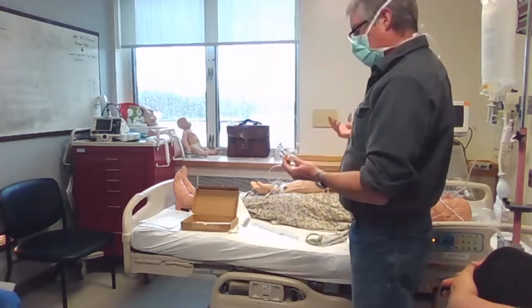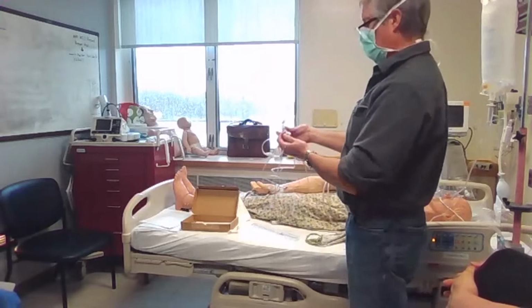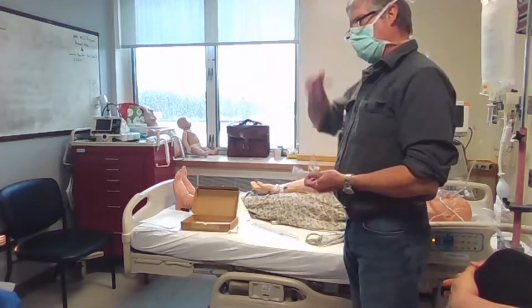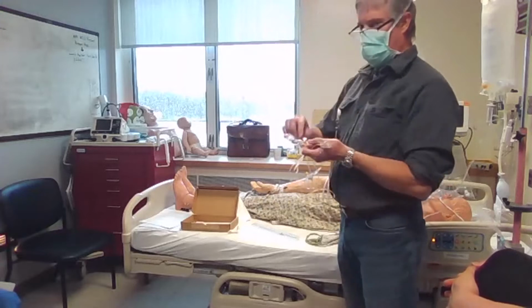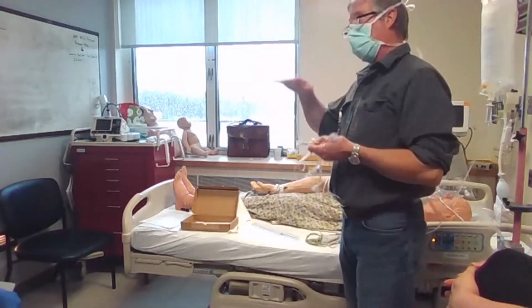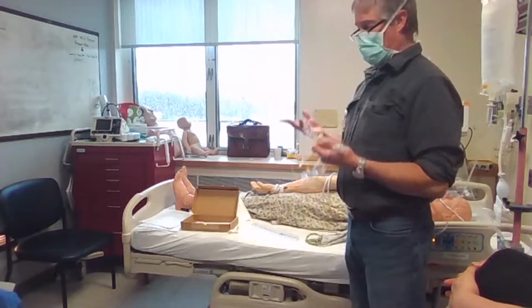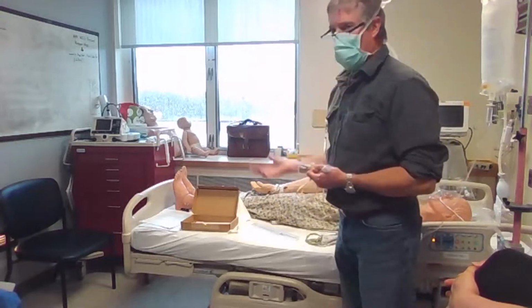So what that means is that when you get a pulse, just like we talked about, it travels through an incompressible fluid, hits the membrane, the membrane moves a little bit, and sends an electrical impulse through this wire to your display, which gives you your waveform. All right, so this is obviously set up to whatever the ambient temperature and atmosphere was when it was made. It could have been made in Salt Lake City, it could have been made in Mexico City, the highest place in the northern hemisphere, or it could have been made at the bottom of the ocean.